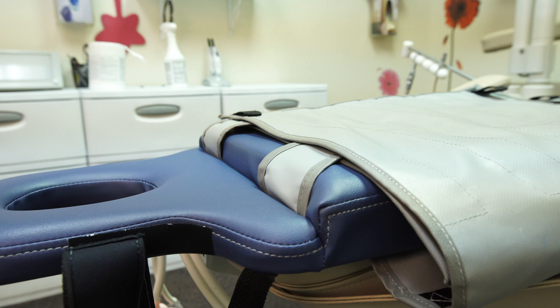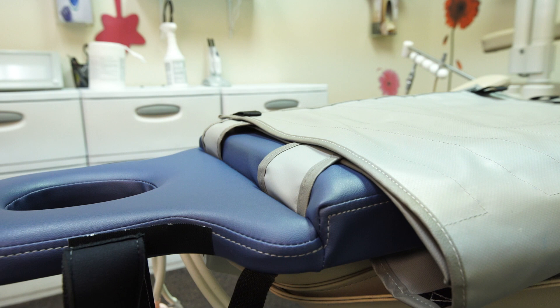The step-down version of the Joey board helps to ensure the optimal chin-up position. The Joey board is easy to clean with any OSHA approved cleaning products.